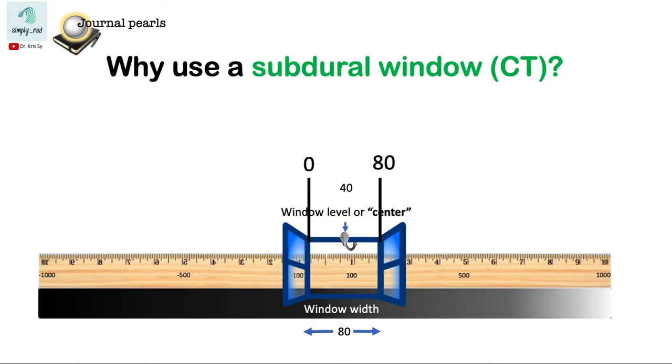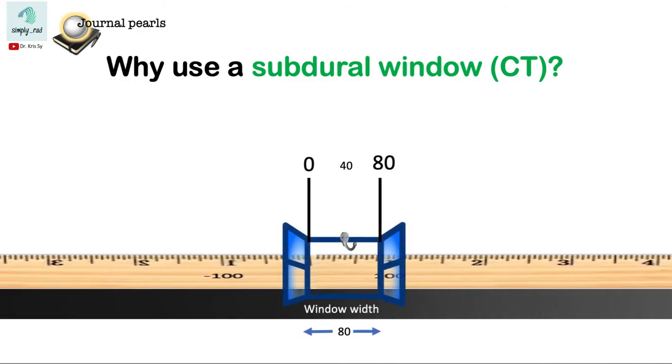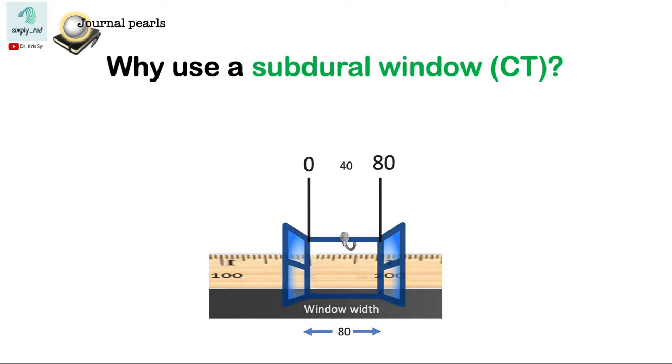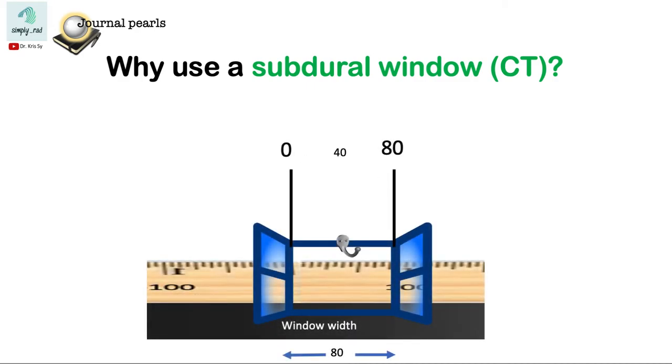Now let's adjust the scale since the ruler should now have 0 at the lower point and 80 at the opposite. Now zooming in a bit. We now realize that both white matter and gray matter are well within this scale and can be visualized in this brain window.